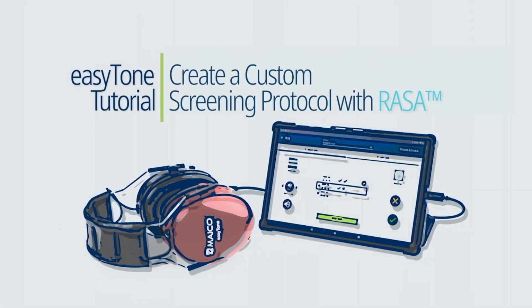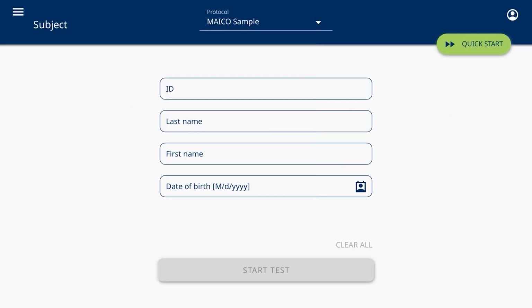This tutorial is to show you how to create a screening protocol. Protocol setting guides the user through the protocol options with simple setting screens. This customizes the device to tailor it specific to the screening program.